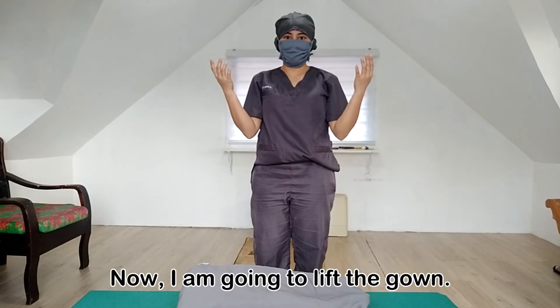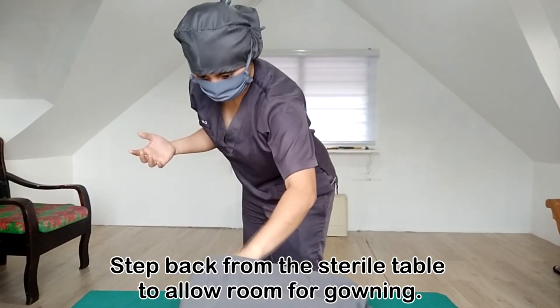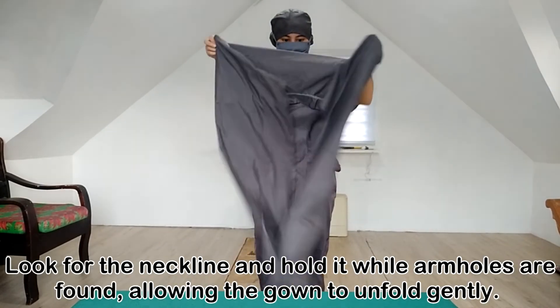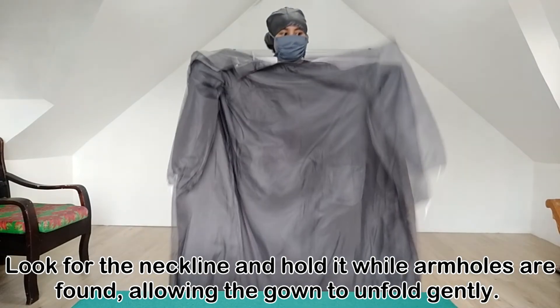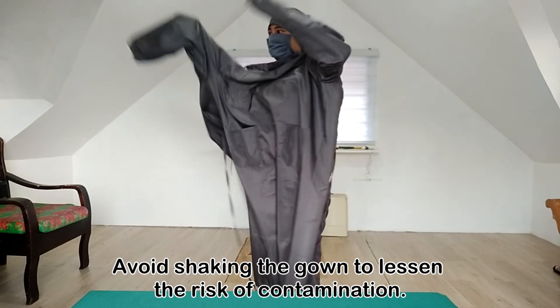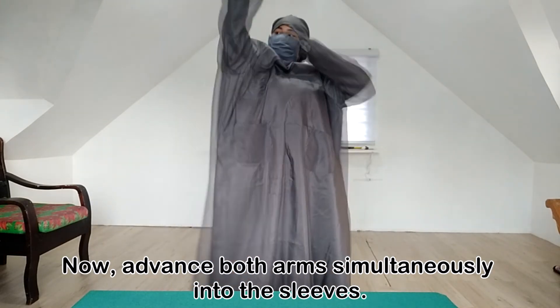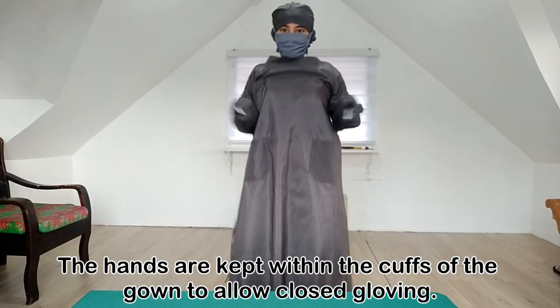Now I'm going to lift the gown. The gown, folded inside out in the sterile pack, is lifted away from the table. Step back from the sterile table to allow room for gowning. Look for the neckline and hold it while armholes are found, allowing the gown to unfold gently. Avoid shaking the gown to lessen the risk of contamination. Now advance both arms simultaneously into the sleeves. The hands are kept within the cuffs of the gown to allow closed gloving.